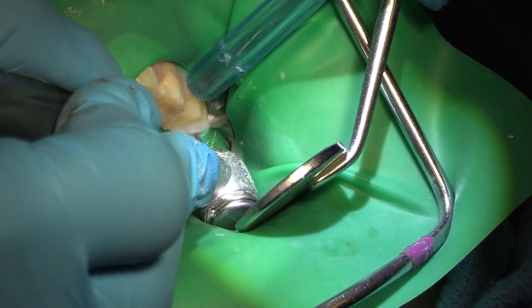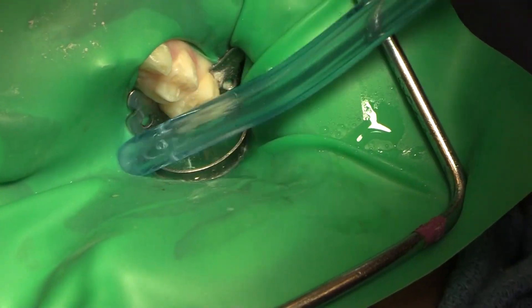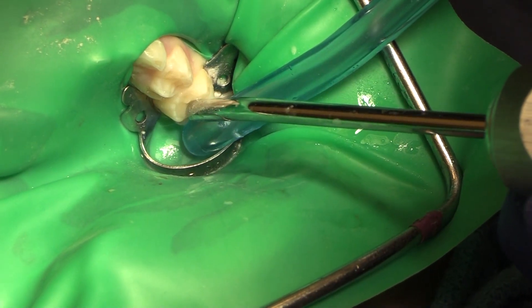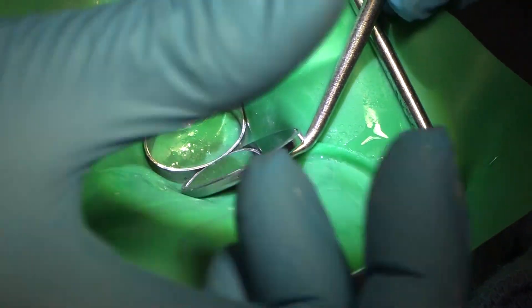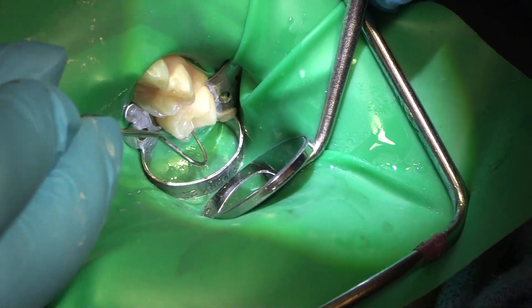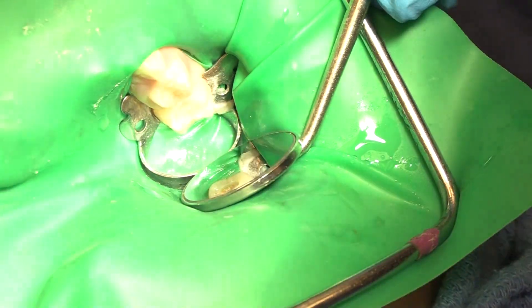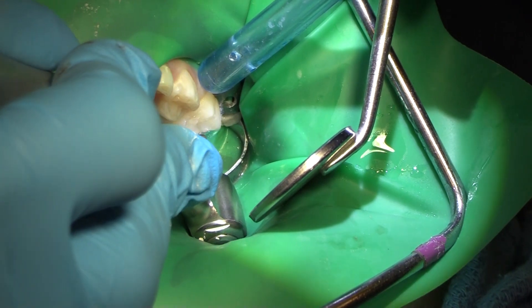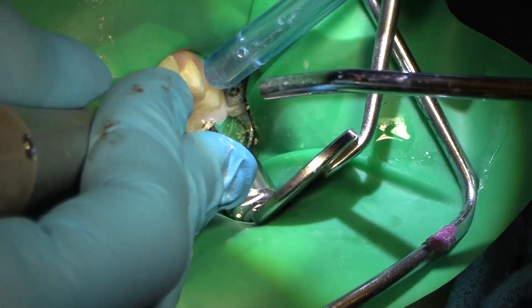Using a high-speed 556 bur to open things up, then we'll give it a little wash and dry and see where we're at. I'll find my explorer and feel that area to see how deep we are. Still lots of soft stuff in there. Before I go into my mesial, I just want to make sure this isn't going to turn into something else. Going in with a big round bur to get out that decay and see how far down we go.